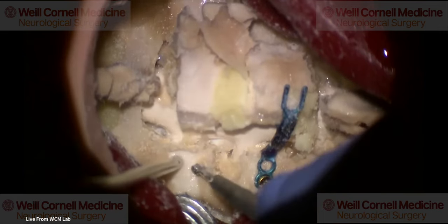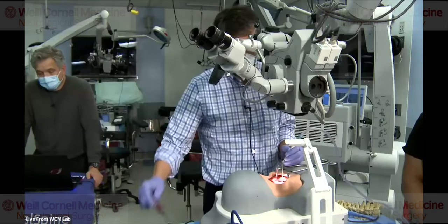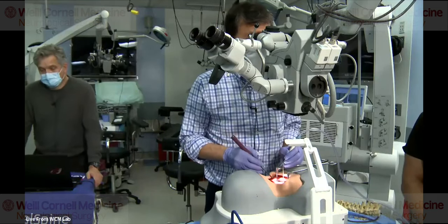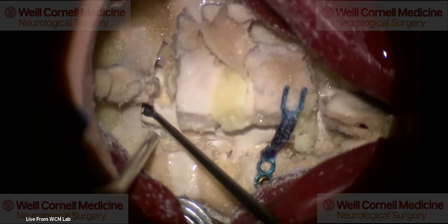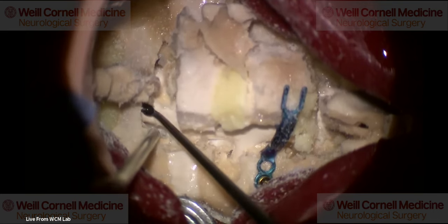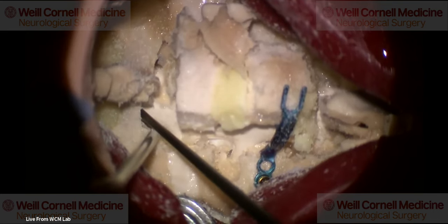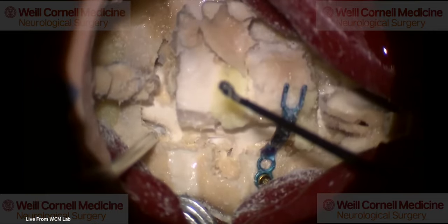And then I want to make sure that it can still shingle and that this isn't going to hit that. I would put a plate there and then put some Depomedrol underneath. I use a little angiocath, a 1cc syringe, use 80 milligram per cc Depomedrol, and use about half of it, and put it underneath the lamina here and squirt distally. And then I put some into the subcutaneous tissue there.